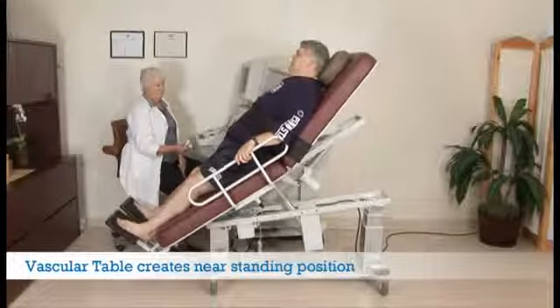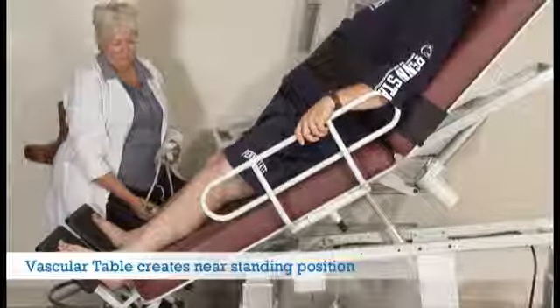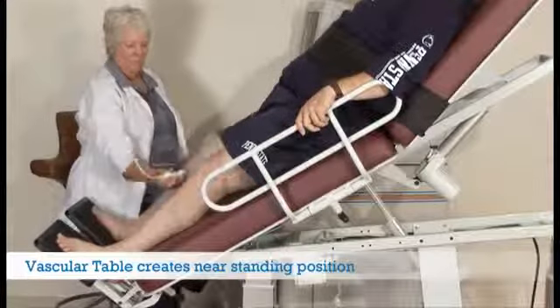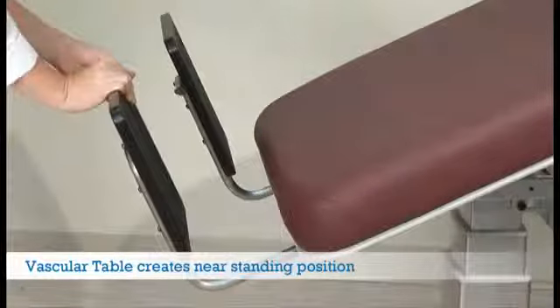The Oakworks vascular table with two section top, 40 degree tilt, and powered fowler creates a near-standing position to facilitate reflux studies. Combined with on-demand height adjustments, sonographers can work comfortably and safely.